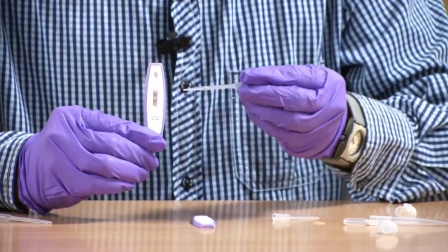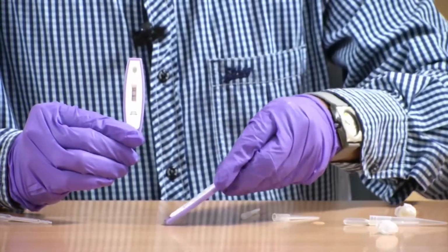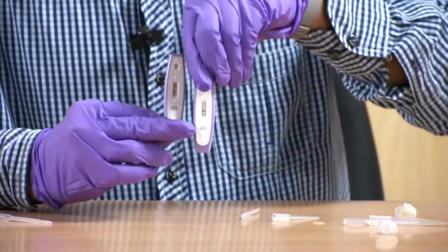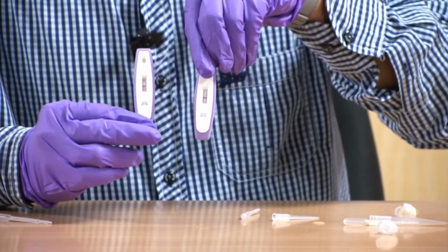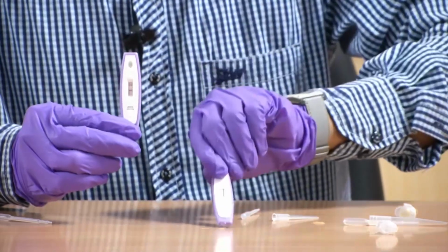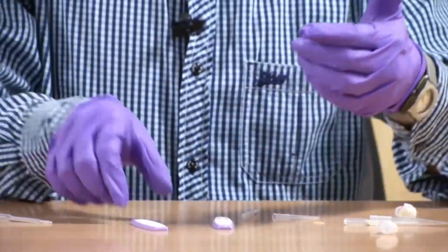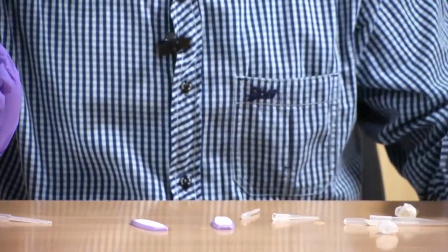You are able to see the 2 lines in case of the urine sample, and in case of water you are able to see only 1 line, only in the control. In the case of the urine sample you are able to see 2 lines. So, by using a simple experiment you are able to understand the concept of lateral flow assay. I hope you understood the concept of lateral flow assay.